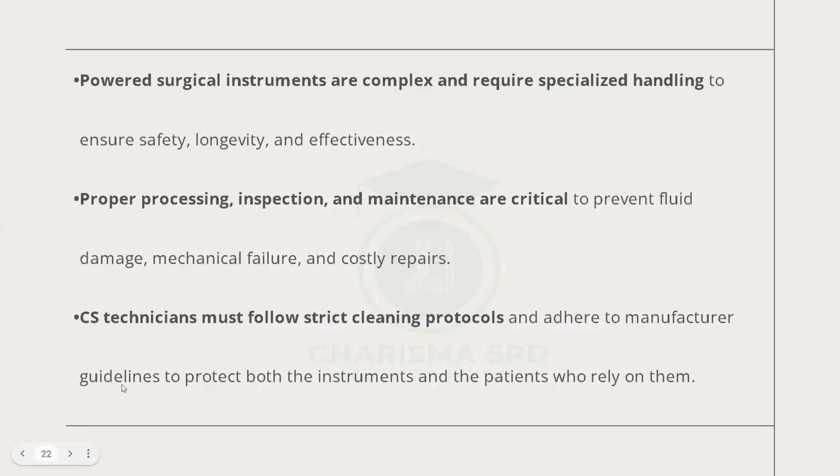So we have the battery powered. I'm just going to give you a rundown before we get to the endoscopy part of the surgical instrument. So with the battery, it is powered by a battery. The battery needs to be charged. It means that the surgeon doesn't need a foot pedal, because the battery connects to the handpiece. So the surgeon holds it.